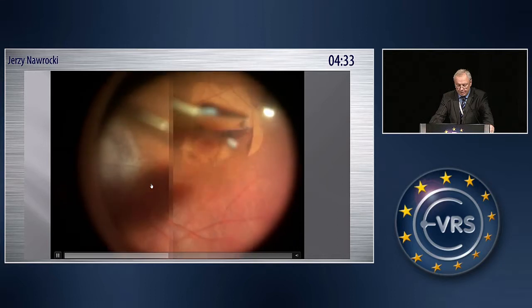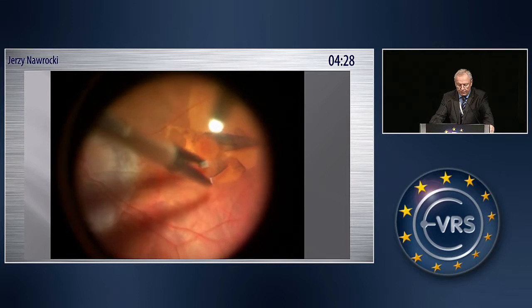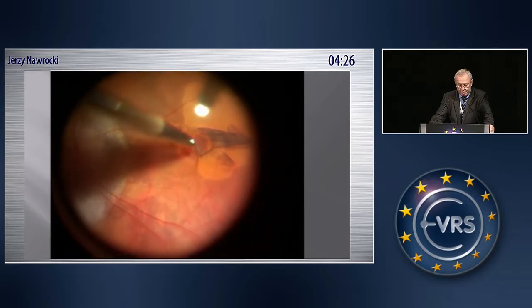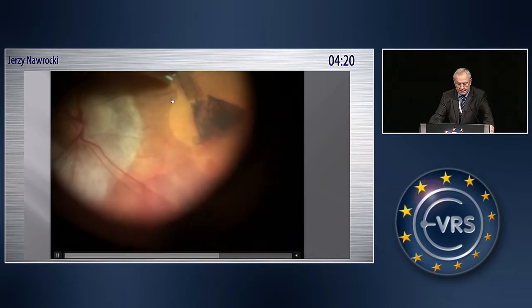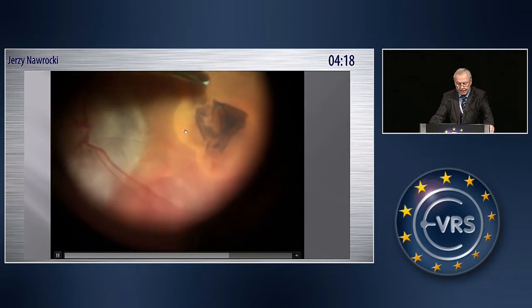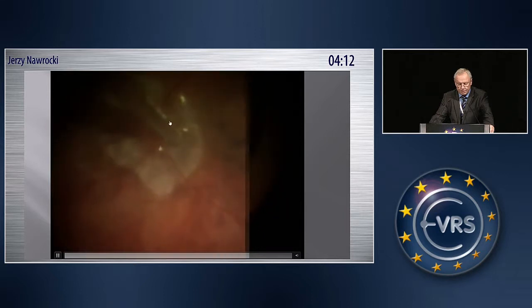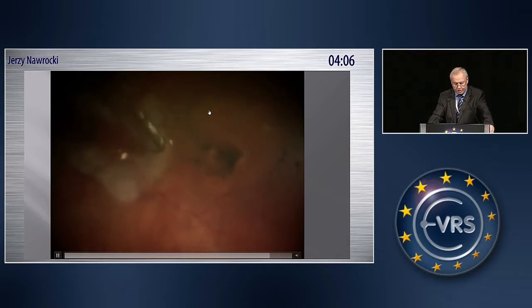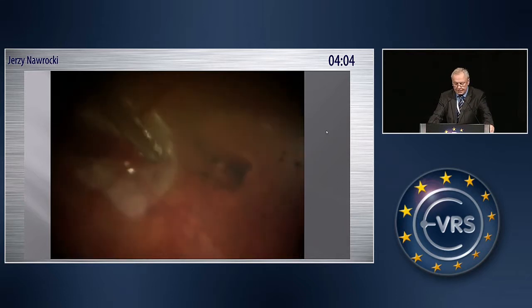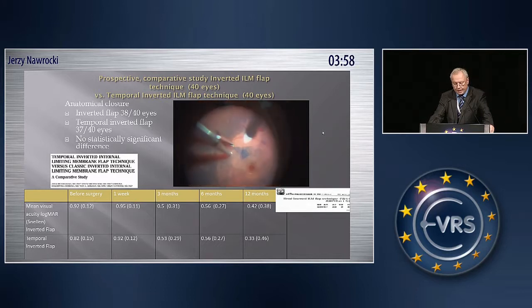But in these cases, we covered the macular hole with several layers of ILM, as you will see in a moment. But also, if you look at this area, during fluid air exchange, the nasal part of the ILM flap moves into its original position. Actually, this led us to modification of the technique, and we found that a temporal flap is enough to close the macular hole.